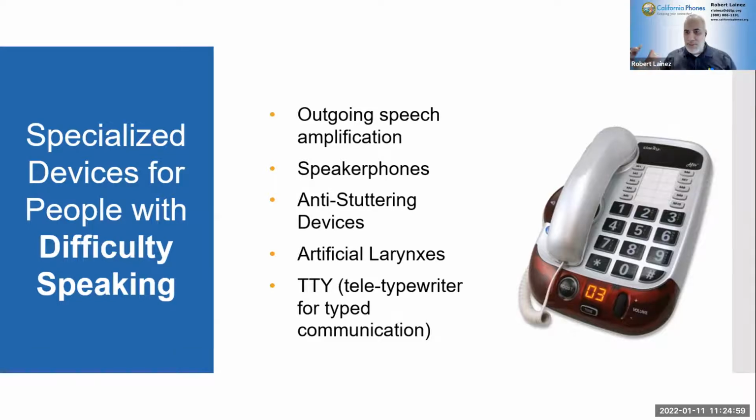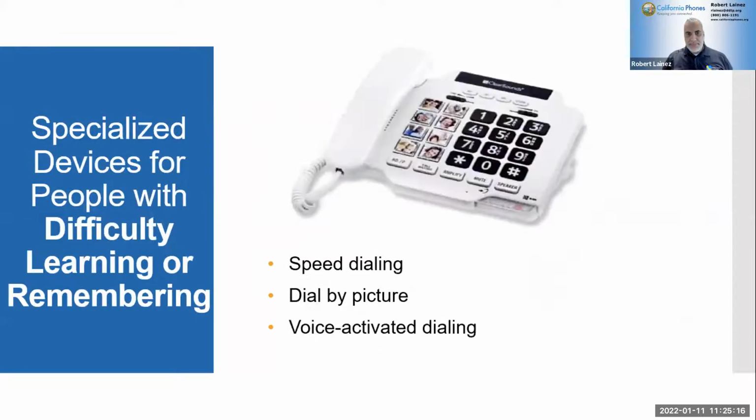Hopefully you were able to hear that. This is an artificial voice generator. Like I said, it has nothing to do with the phone, but this is some of the devices that we do have available. And of course, we have teletypewriter or TTY devices as well.